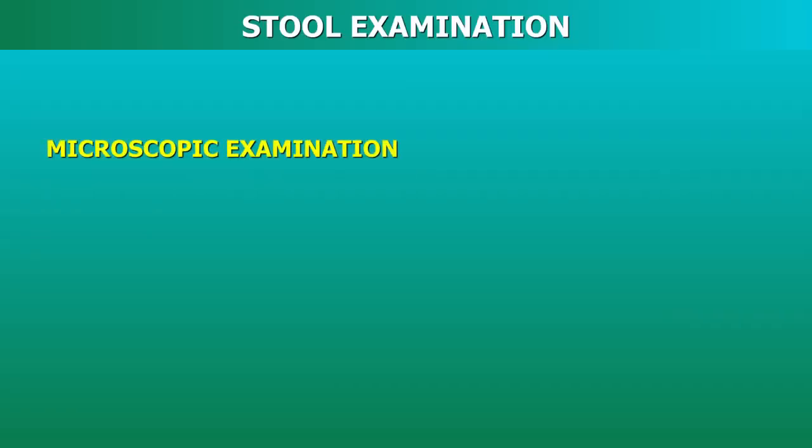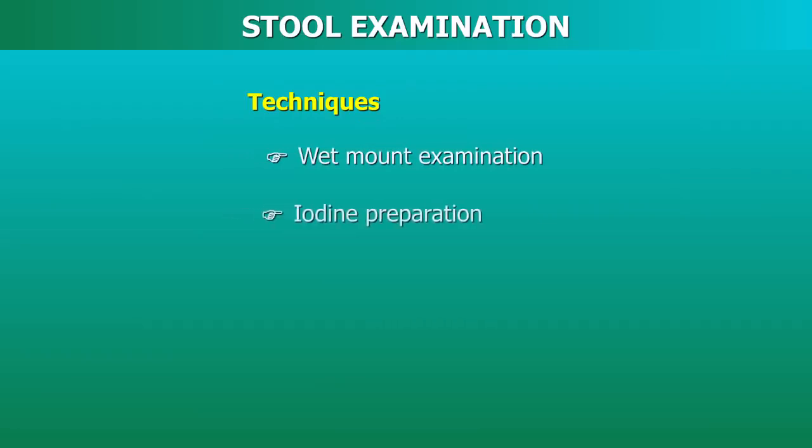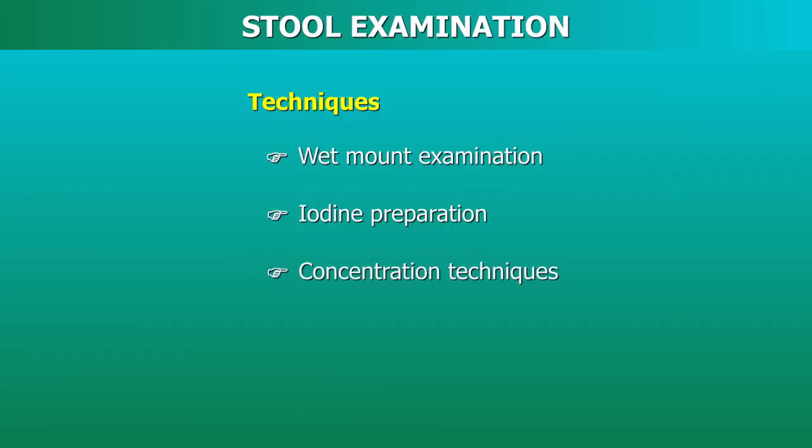Microscopic examination. The laboratory diagnosis of most parasitic infections is by the demonstration of ova and cysts of the parasite in the stools of the infected person. The stool can be examined by the following techniques: wet mount examination, iodine preparation, and concentration techniques.